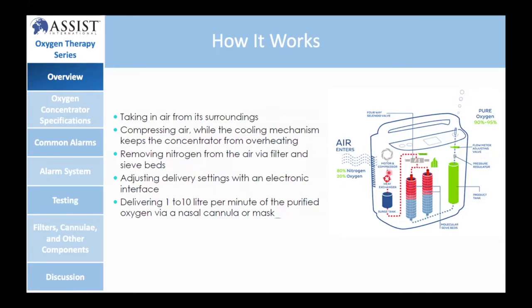So the compressor takes atmospheric pressure in, which is around, let's say, 14.7 psi, and then it compresses it up to 50 psi, and then it leads to the two sieve beds. You see the two cylinders you see there, red on the top. So then this is a sieve bed. In this sieve bed we have a zeolite material.